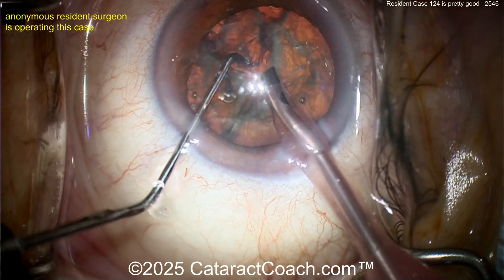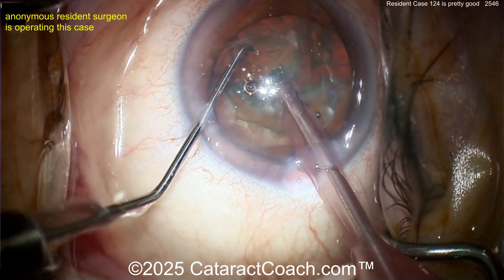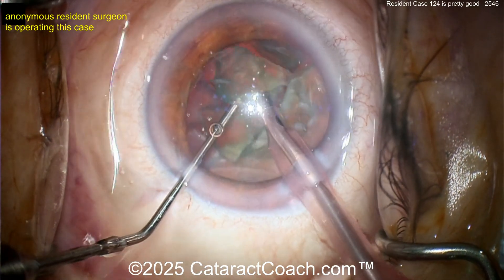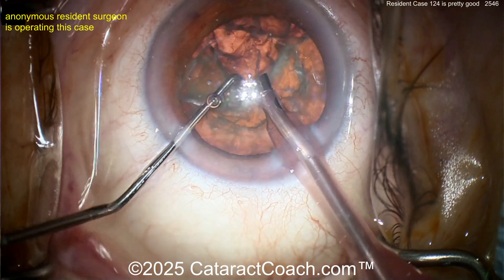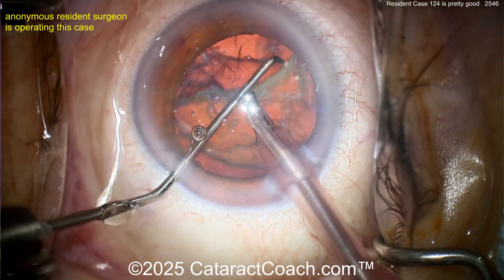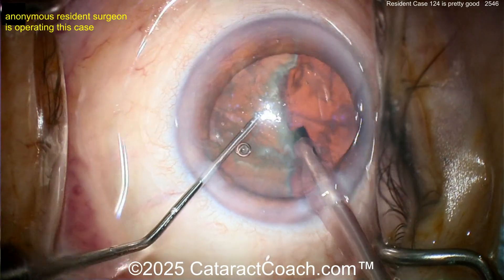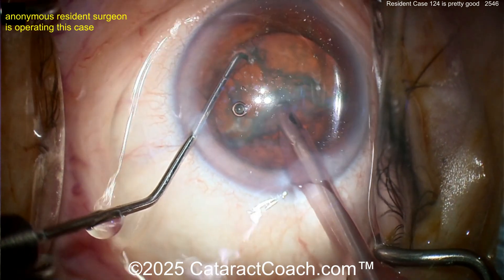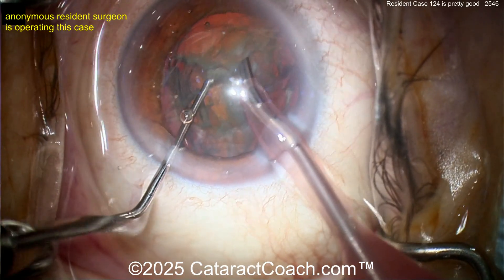Now get out the other quarter — rotate it around, bring the piece in front of you, buzzing a little bit. Go to vacuum, bring the piece up. Even another sub-chop, beautiful. Get these pieces out nice and easy. Now look at the anterior chamber — there's a little bounce. The eye is also being pushed toward the nasal canthus. Get the eye back in primary, put the right hand down. You're lifting up on the right hand — that's the problem. Rotate it around, half a nucleus left. Buzz into the hemi-nucleus, bring it forward, get the chop around the equator — there it is, beautiful chop.